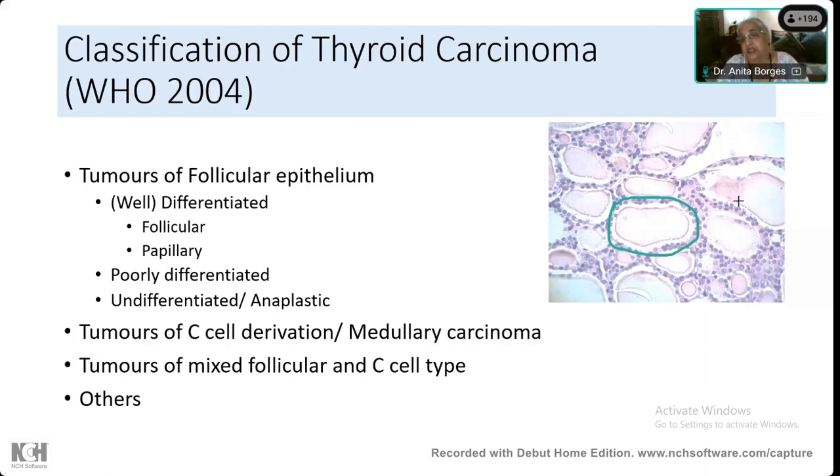Deepak, if you can show me one oval cell, I will give you anything that you want. Is there a single oval cell? The answer is no. They are all perfectly round. So the nuclei are round. The cells can be cuboidal, they can be short columnar, and maybe, like you said, if there is a lot of activity, it may actually be a little more columnar. Excellent. So that is the description, right?